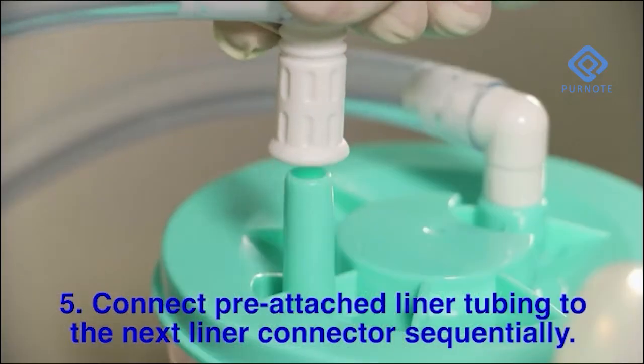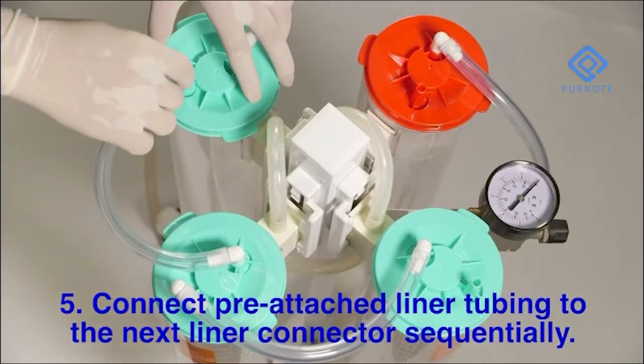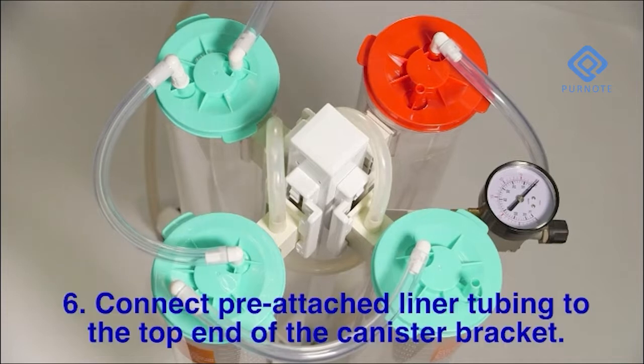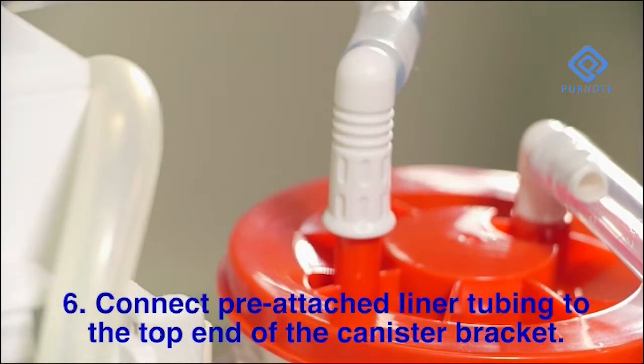Connect the pre-attached liner tubing to the next liner connector sequentially. Connect the pre-attached liner tubing to the top end of the canister bracket.